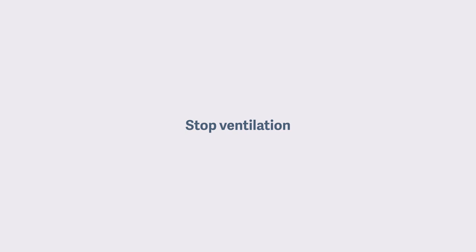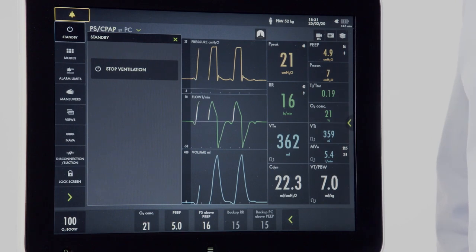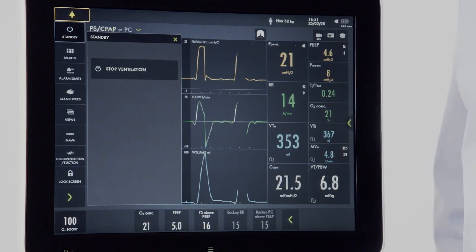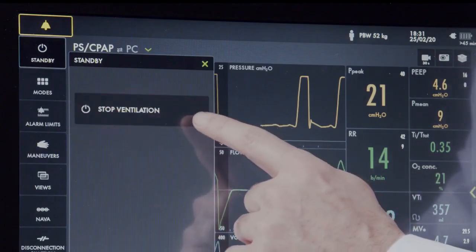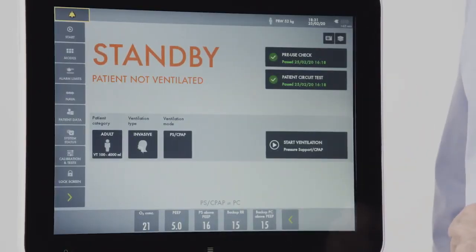To stop ventilation and put the machine in standby, press the standby key. That button alone will not discontinue ventilation — there is a second safety step required to stop the ventilator. From here, I have a stop ventilation option. Pressing and holding this button for two seconds will place the device in standby.